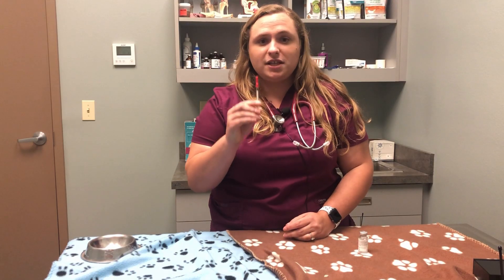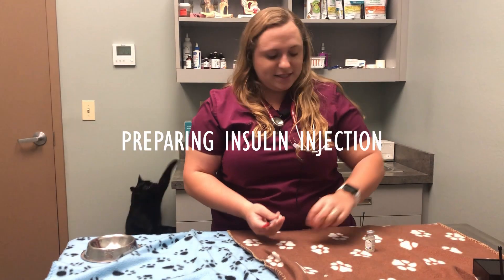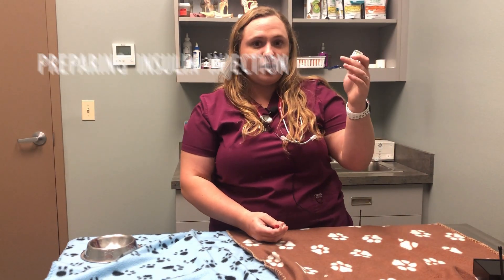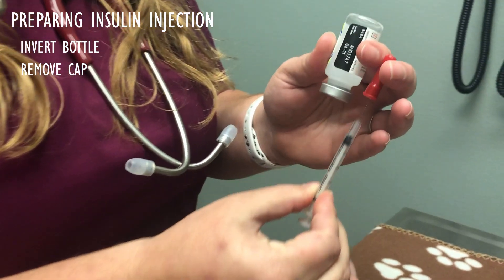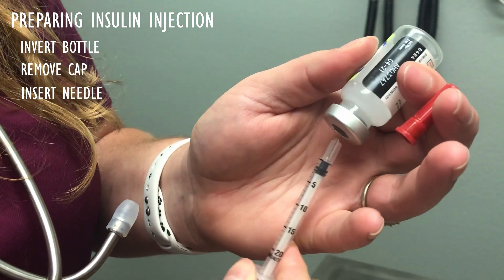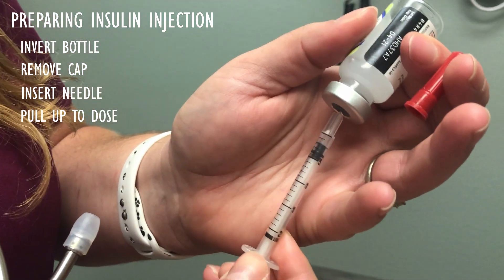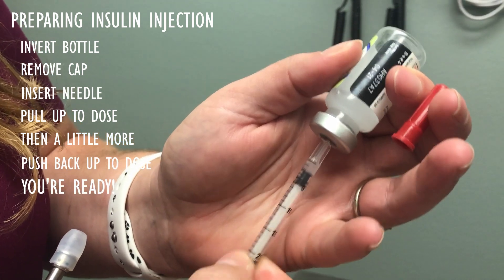This is your insulin syringe. Keep in mind that each insulin has its own type of syringe — make sure with your veterinarian that you're using the correct one. To pull up insulin, you need to turn the insulin bottle upside down, remove the cap, put the needle into the top, and pull all the way up to the labeled dosage.